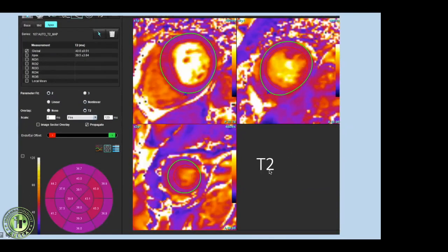T2 mapping values are important for myocardial edema, and increased values were seen in the septum — as expected, T2 mapping values will be elevated in acute MI.